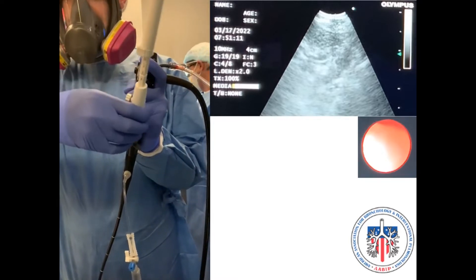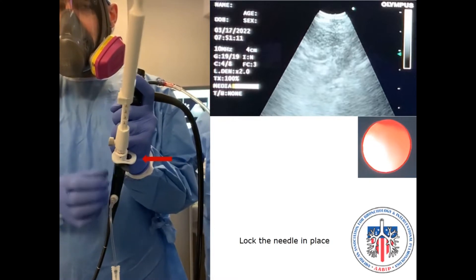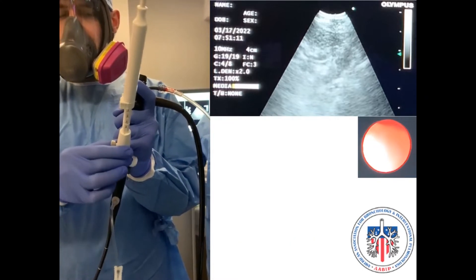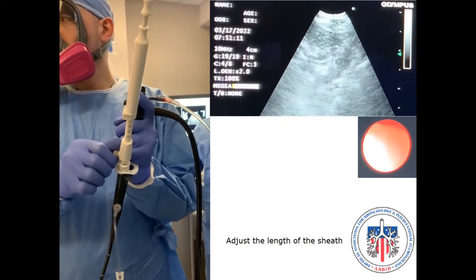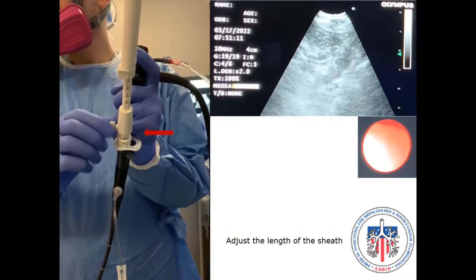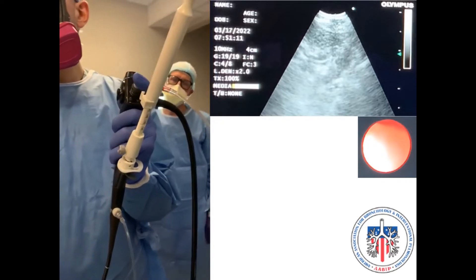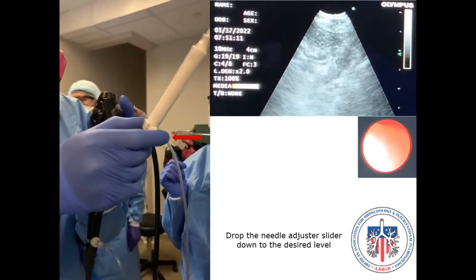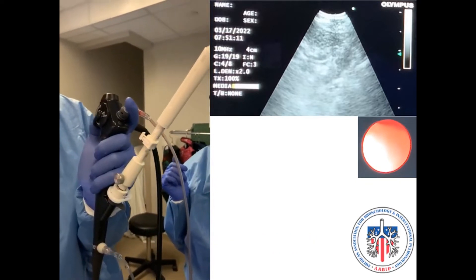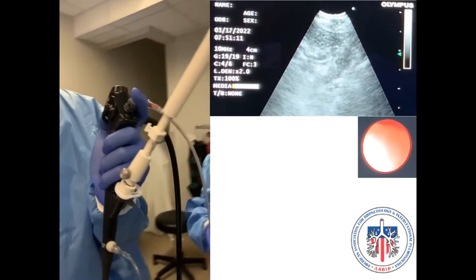Secure the needle in position by moving the connecting slider to the opposite side until it clicks. Adjust the length of the sheath. Adjust the needle lever to the desired position based on the estimated depth of the lymph node on the ultrasound image.